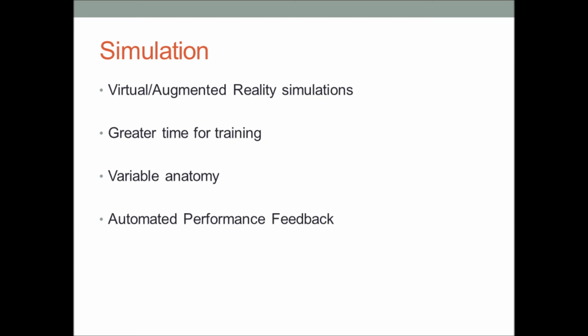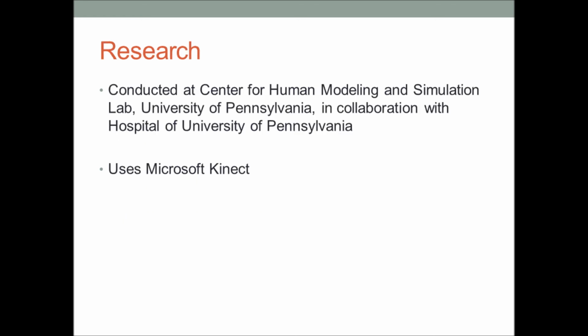We can use augmented reality and virtual reality simulations for giving the same experience to new anesthesiologists as working with the real device. This gives more time for the trainee to practice before using the technique on an actual patient. This also gives an advantage of working on different types of people because the computer can generate different types of internal anatomy. At the end of each training session, the trainees get a feedback on how they have performed. This is a hot area of research.